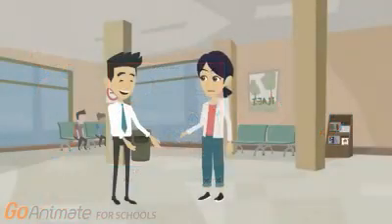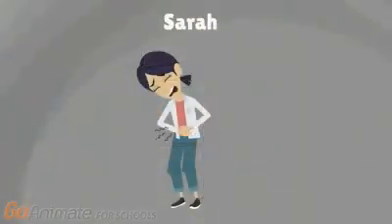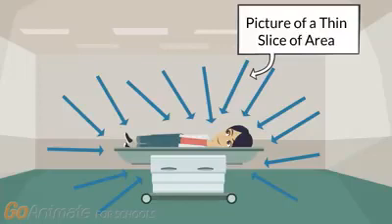After finishing his MRI scan, Michael meets Sarah, who just underwent a CT scan for her severe abdominal pain. A computerized tomography scan produces detailed images of the body mainly through the use of X-rays. Several beams of X-rays, all from different angles, are sent through the body during a CT scan. Each angle provides a picture of a thin slice of the area being analyzed.